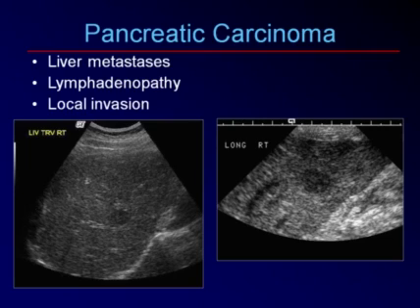Now, after we've assessed the pancreas, it's very common for the pancreatic cancer to metastasize to the liver. So we're right there. We check the liver. Here's a metastasis, a focal lesion. Here's another patient. This changes everything. This is now stage 4 disease. You can easily take a needle, stick it in there, get tissue diagnosis, and have a diagnosis in 24 hours.